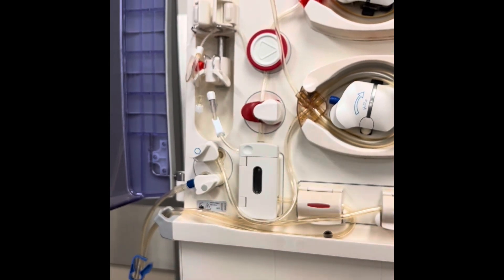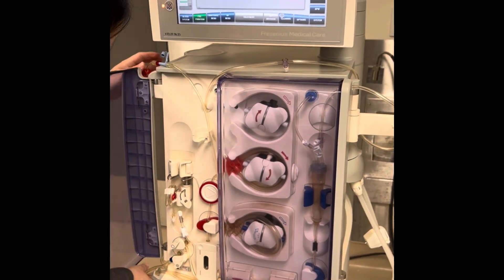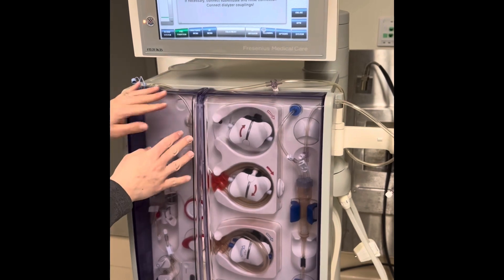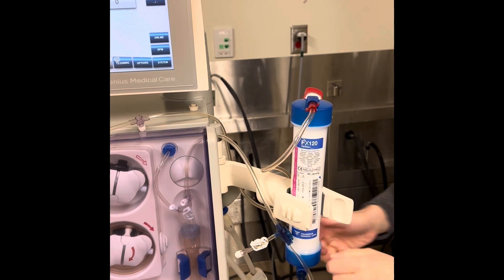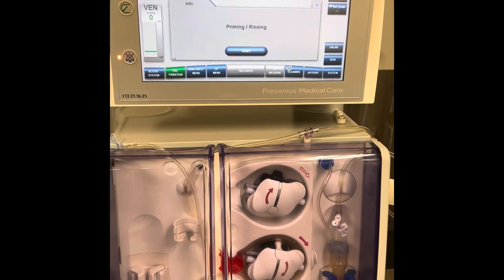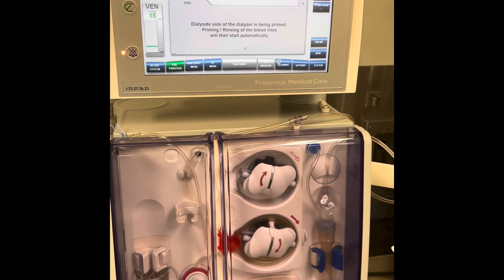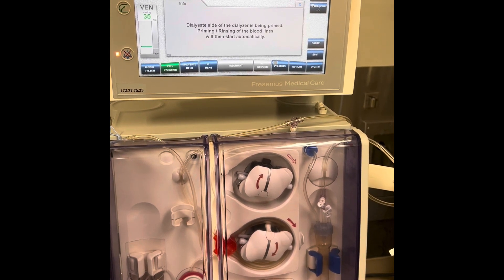Now if you can see, everything is connected. I'm going to connect my dialyzer couplings and close my door as well. My screen has changed and it's now indicating priming or rinsing, and we're going to start. You can see it's indicating that the dialysate side of the dialyzer is being primed, and then priming and rinsing of the blood lines will start automatically.